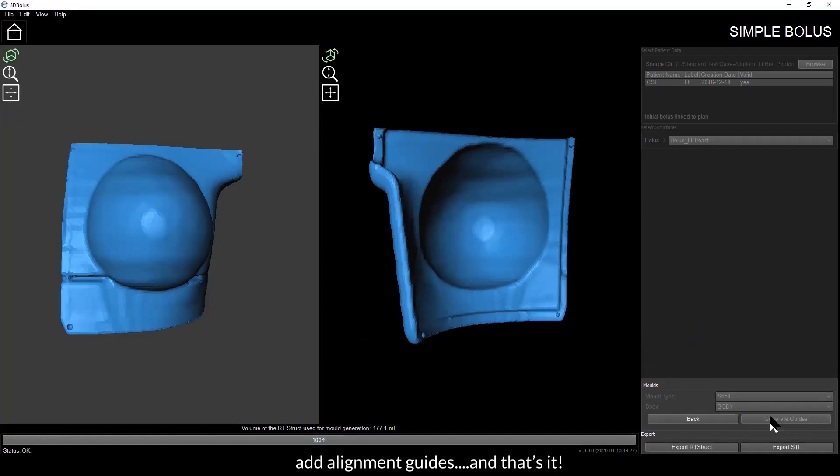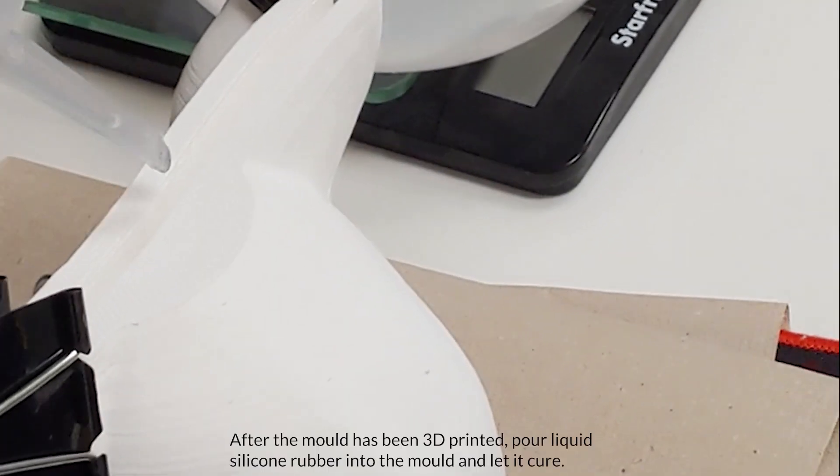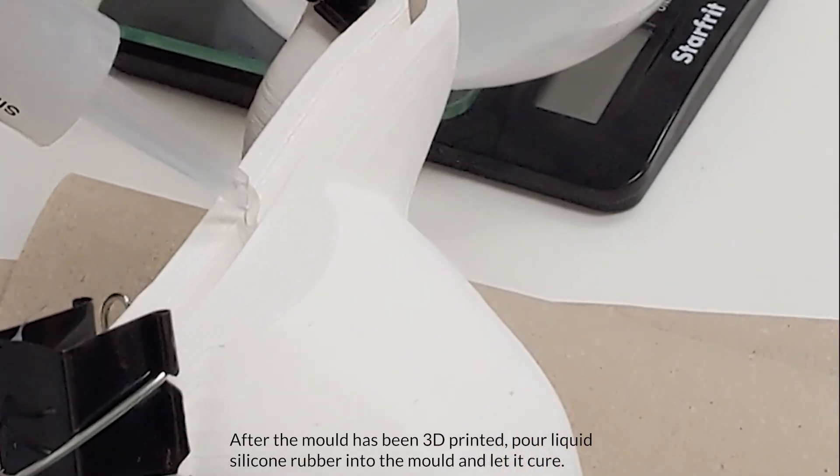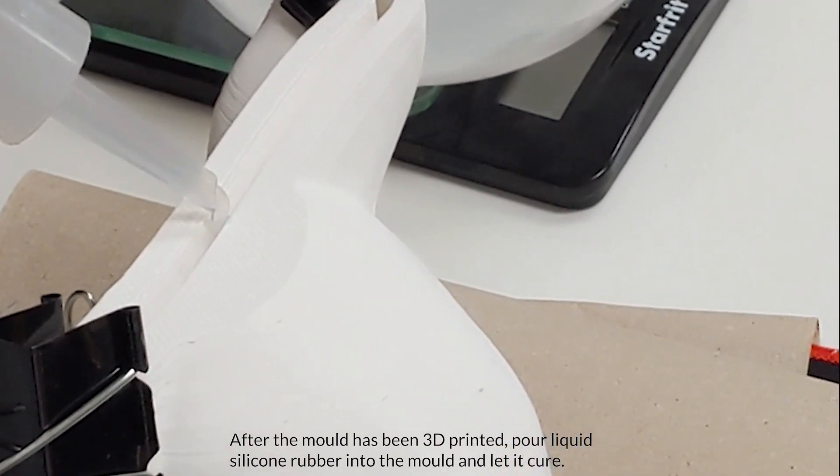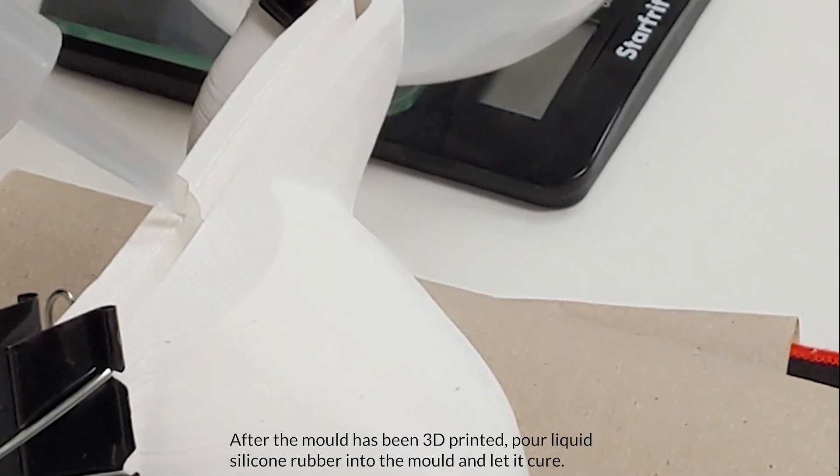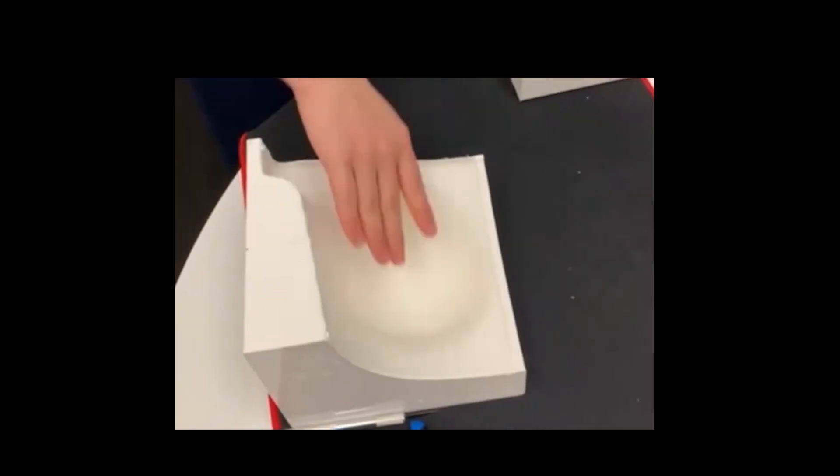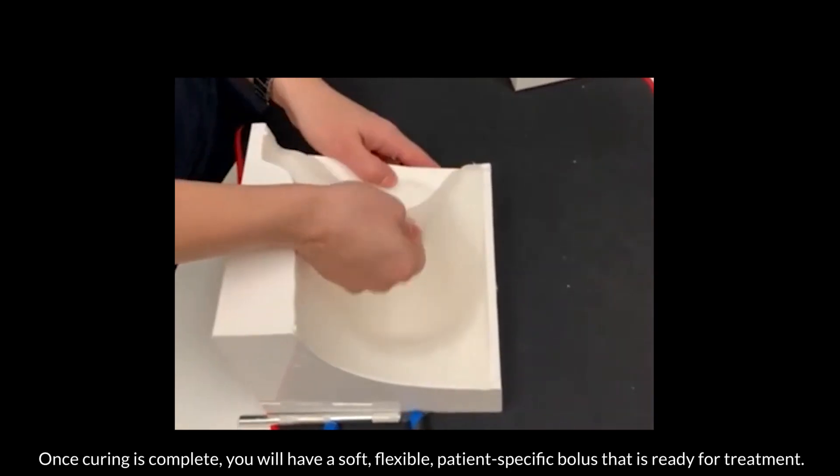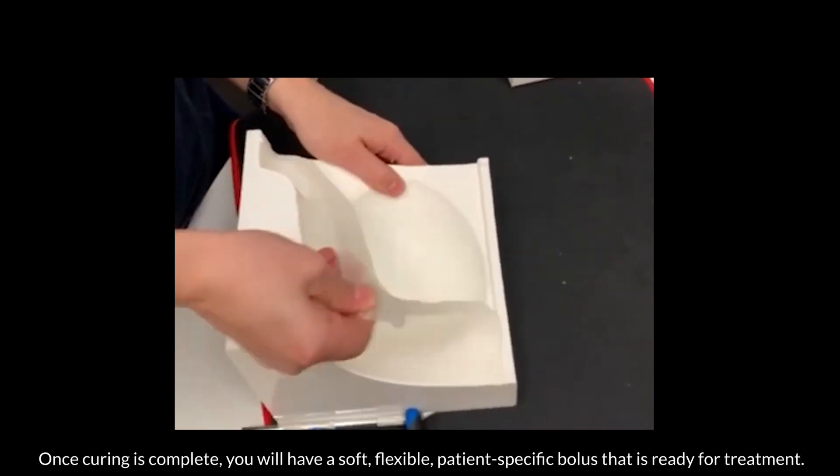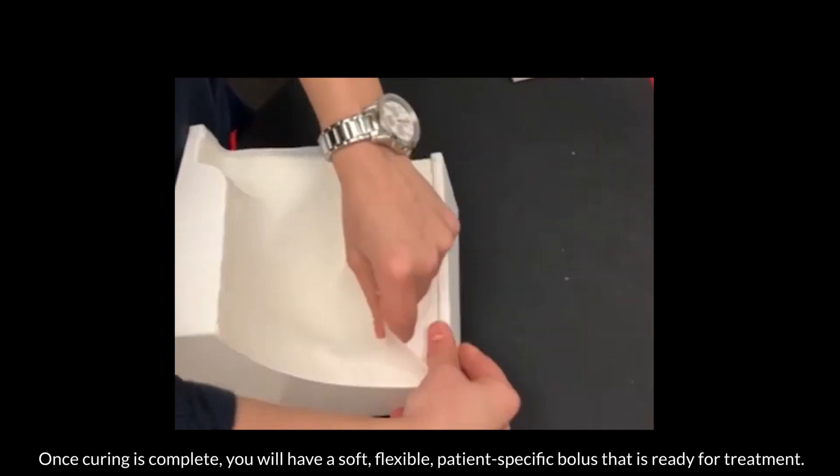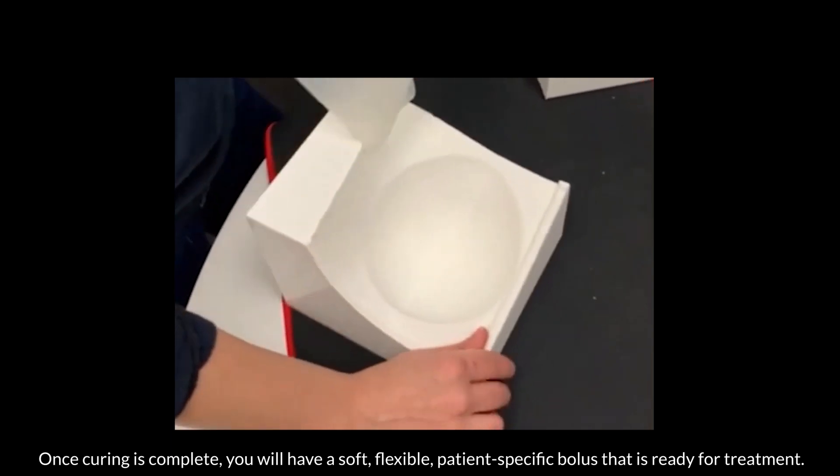After the mold has been 3D printed, pour liquid silicone rubber into the mold and let it cure. Once curing is complete, you will have a soft, flexible, patient-specific bolus that is ready for treatment.